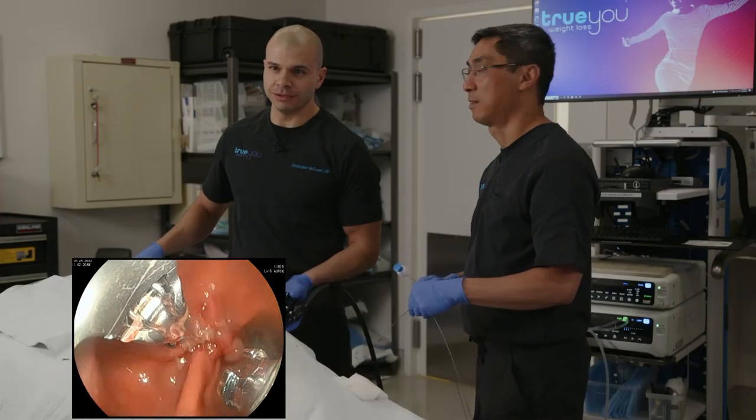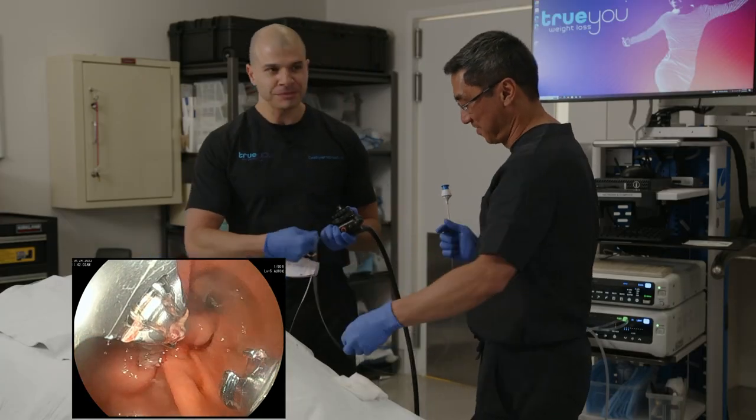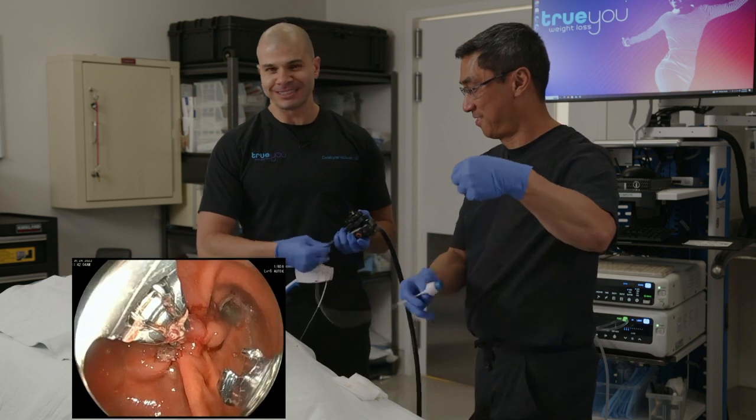I think we could do one little hit right here. I agree. Thank you. All right. We'll go ahead and put one more suture. Yeah, I'll take another question.